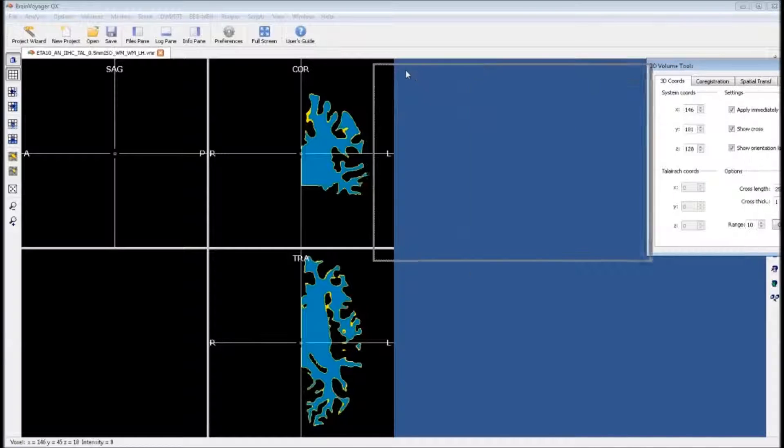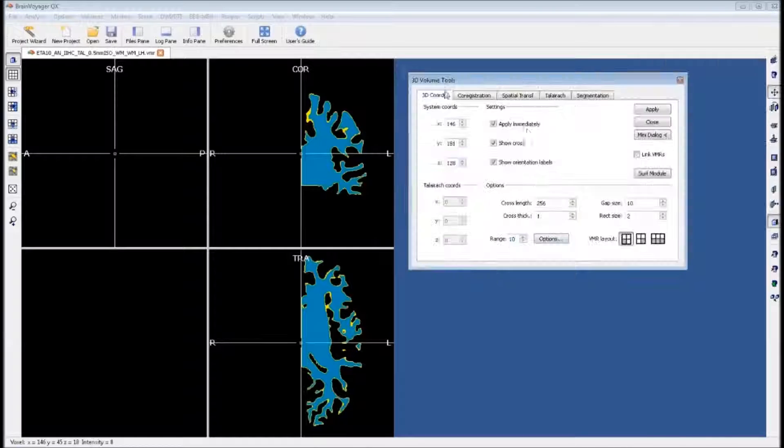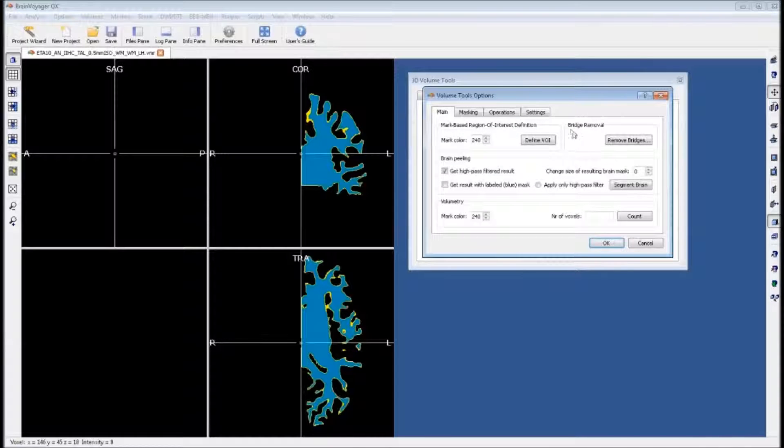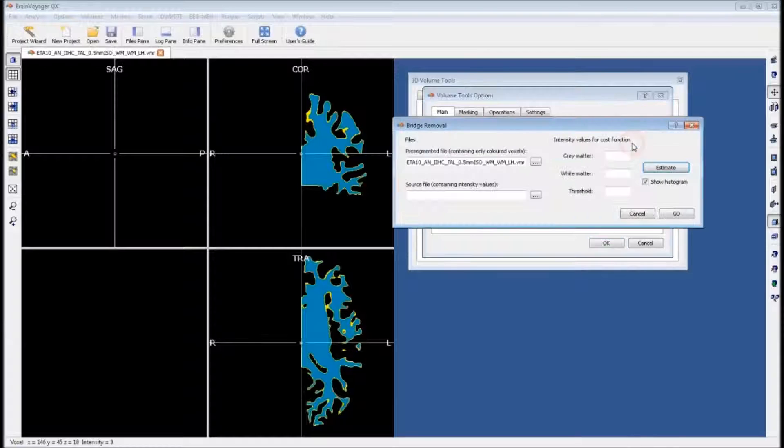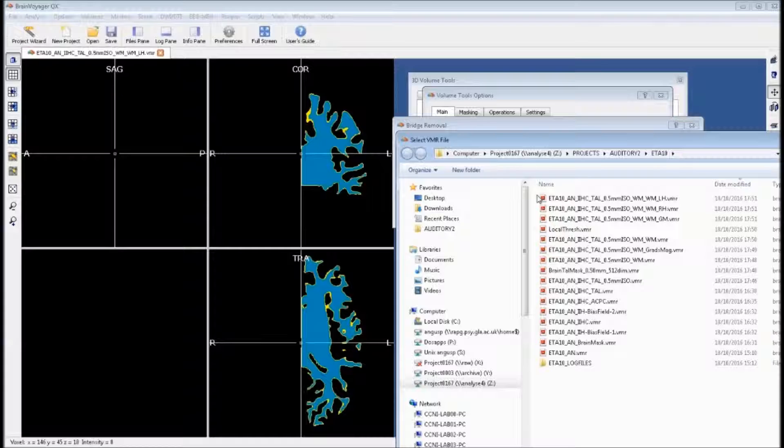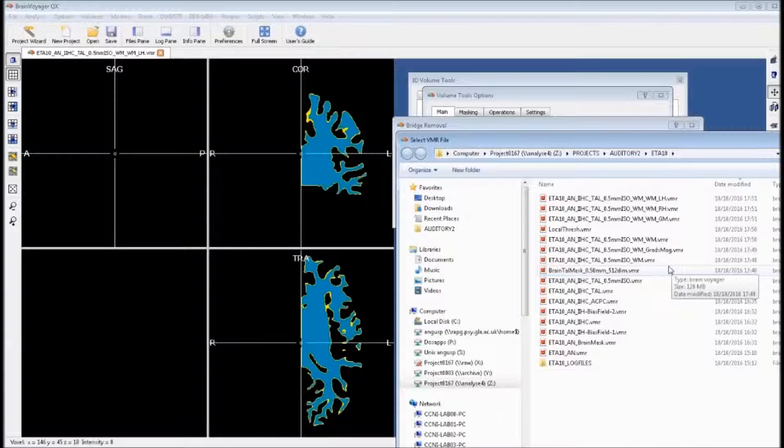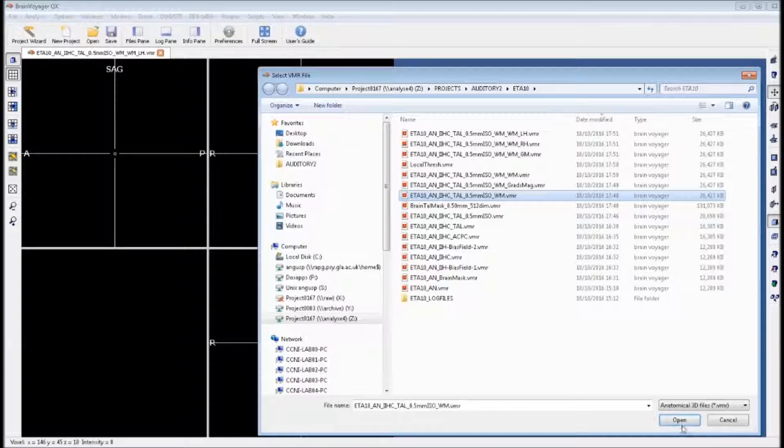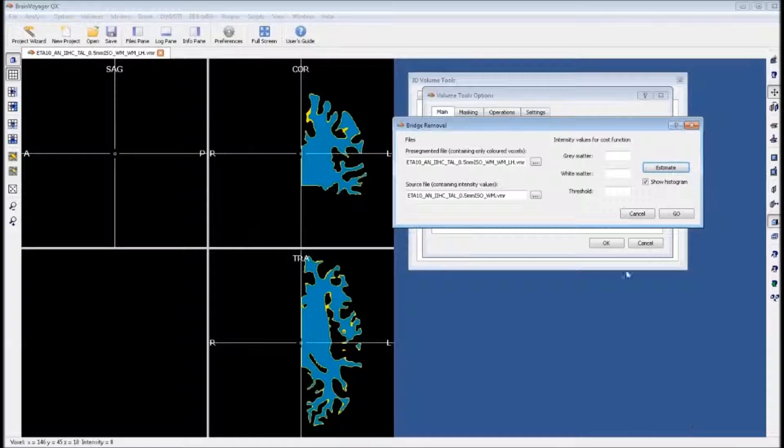For the next step, we will need our 3D volume tools, specifically the segmentation tab. If you go into options, there's an option for bridge removal. For this, it needs a source file containing intensity values. The one we want to give it is the one we labeled with underscore WM, the high resolution VMR with the cerebellum removed.